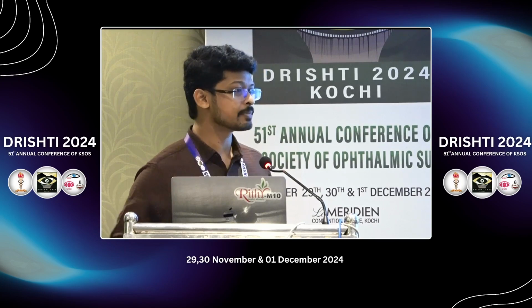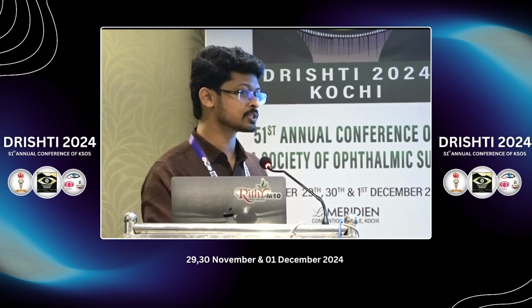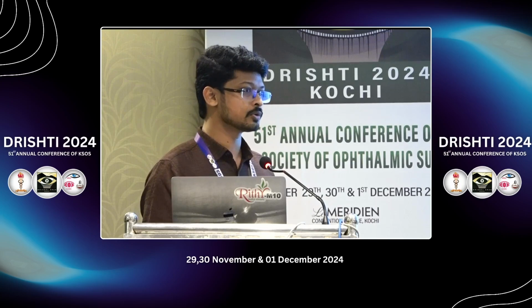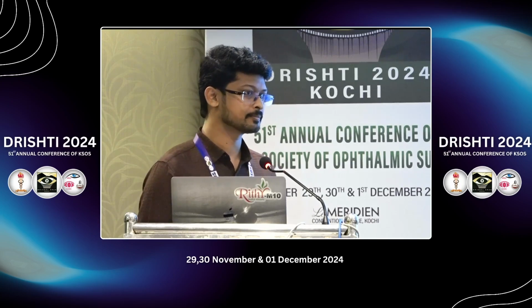If there is edema in acute conditions, if there is higher edema and distortion of inner layers, there will be segmentation errors and more artifacts in the superficial layers. So you can get it with your OCT only. Oh yes, sir. Oh yes. Thank you.